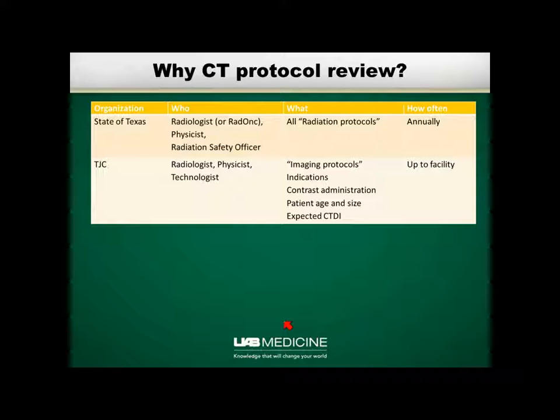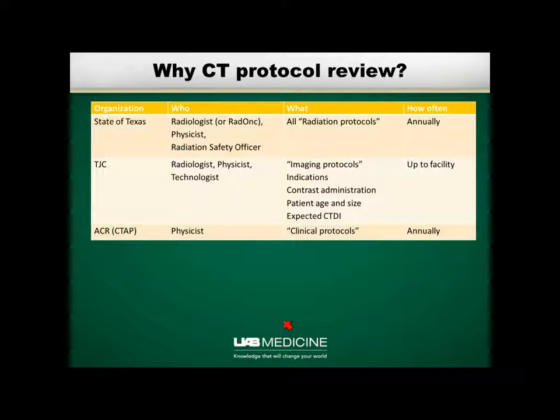What makes this a little bit easier is the periodicity is up to the facility. If you touch each protocol once every 10 years, that satisfies the TJC. They mainly want to make sure that you have a process of going through these periodically. The ACR, I guess, is the 600-pound gorilla, and the accreditation program there is fairly weak about this. All it states is that the physicist should review clinical protocols annually. It's not even clear whether or not they're saying all the clinical protocols.